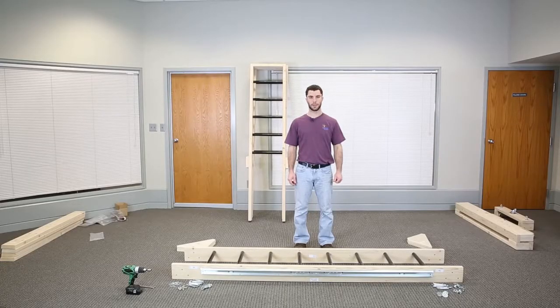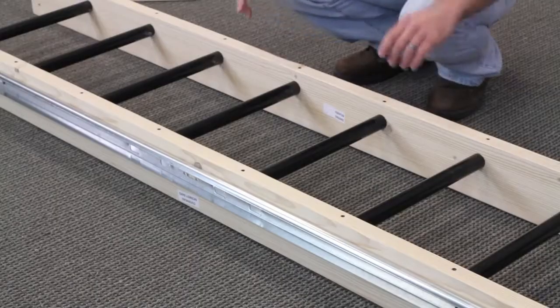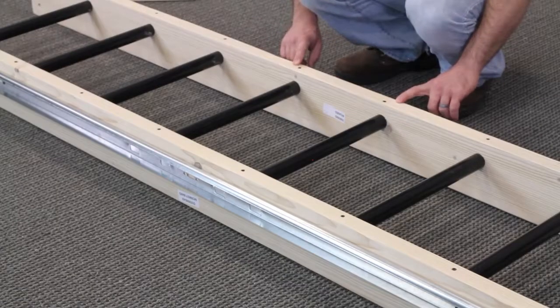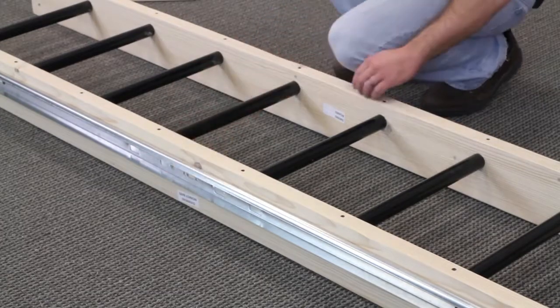The first step to assembling your indoor therapy gym is to take the overhead monkey bars and place them upside down in the middle of your workplace. You'll know they're upside down because the bars will be closer to the top and the assembly screws will be visible upward. Also, the labels will be upside down.